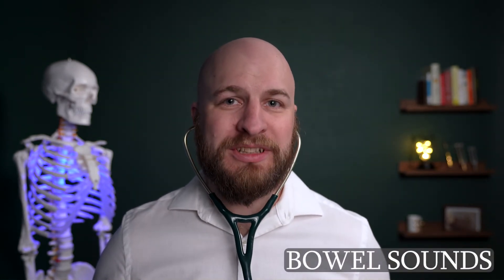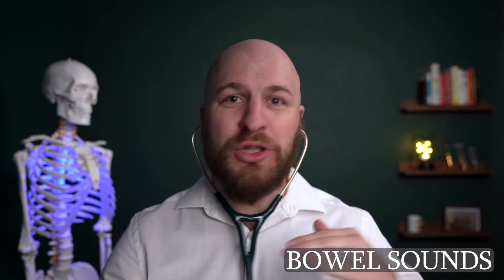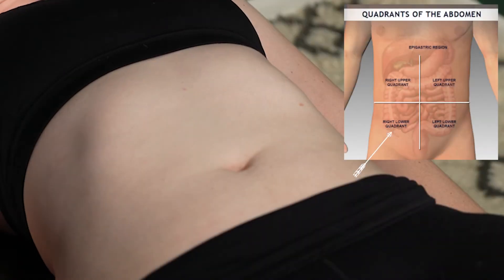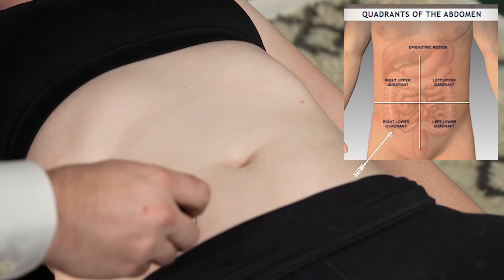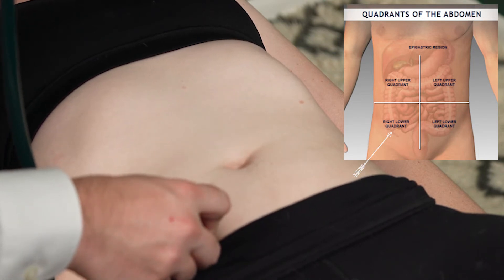The final spots to listen to are bowel sounds. It's important to listen to bowel sounds before you do any palpation of the abdomen, because when you start pressing on it, it can start moving things and trigger peristalsis. You want to listen first to make sure that's happening on its own. I like to start in the right lower quadrant because that's where your cecal junction is, between your small intestine and large intestine — there's usually a lot of movement there, so if there's any movement at all, you'll hear it.